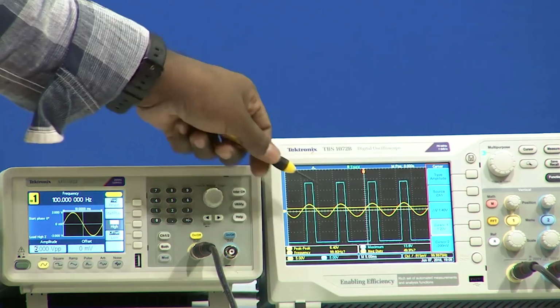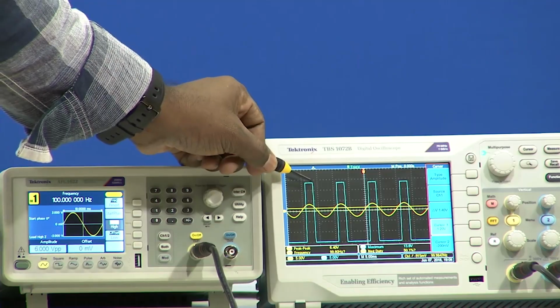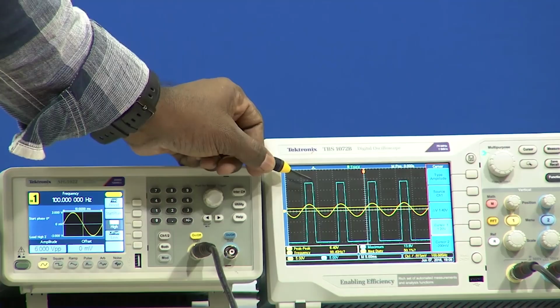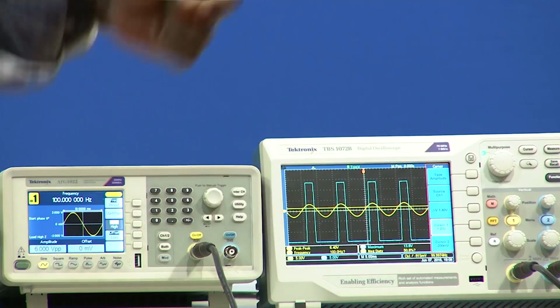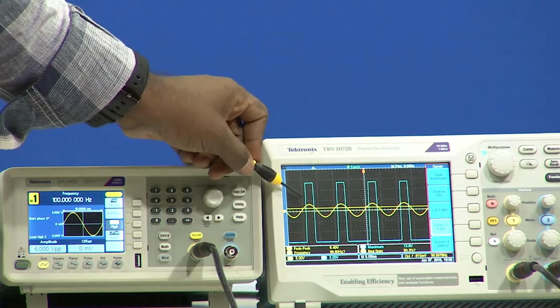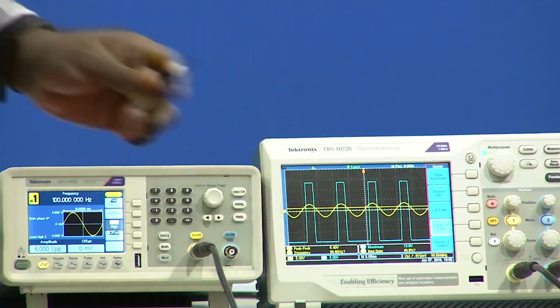Now, when the input is greater than that particular threshold, we can see there is a high value. High in this case is 15 volts, because the VCC and minus VCC that we are applying is plus 15 and minus 15. It is slightly below plus 15 because of the saturation. The output saturation will be lesser than the VCC that you are applying. And when the input is lower than that particular value, it goes back to the minus VCC state.